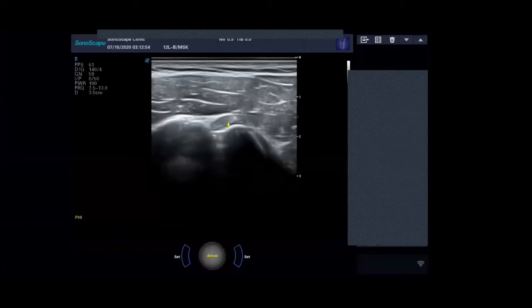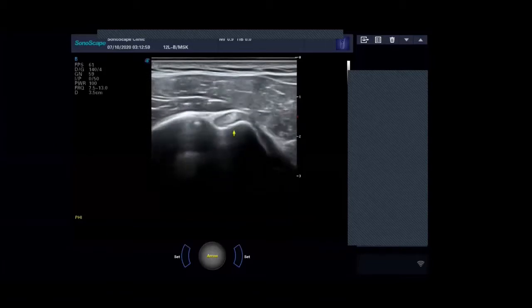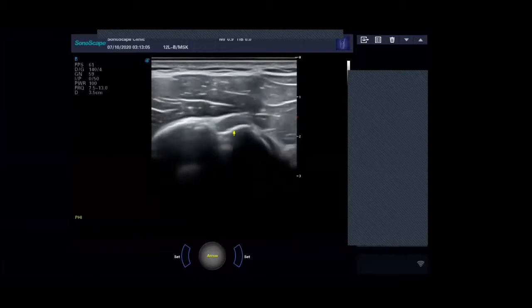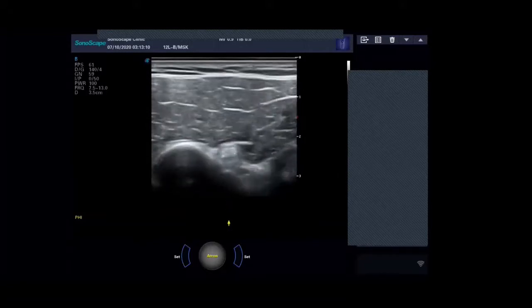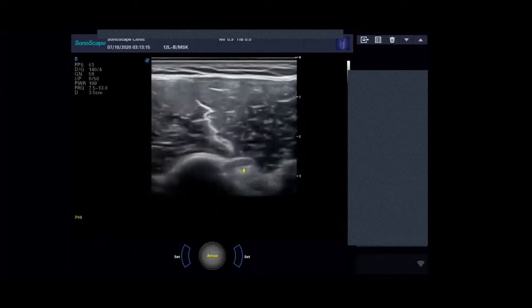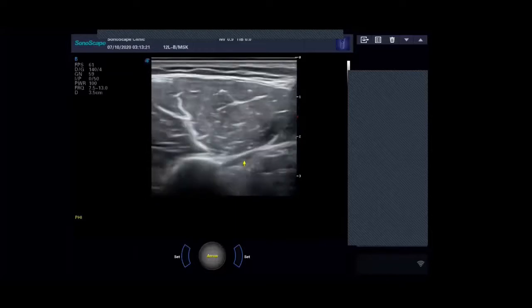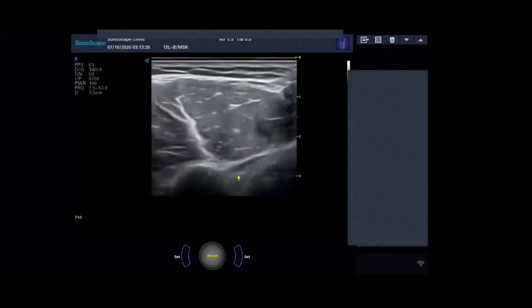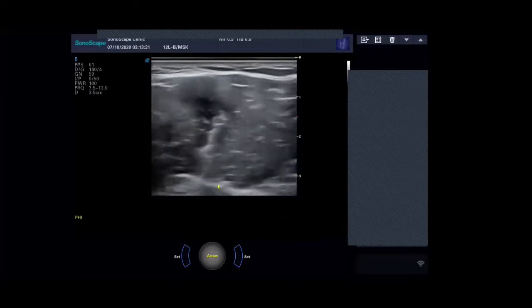Looking here, this is bright, and now it's dark, and now it's bright again. So that's what you want to optimize, so you're looking at a bright image of that tendon all the time. Okay, so then I tend to move that out of the way, I tend to go down the arm, and you can follow it here, keeping it bright all the time. You may have to angle slightly until you come to the pec major tendon here, okay? And that's where you follow it to. And then back up.